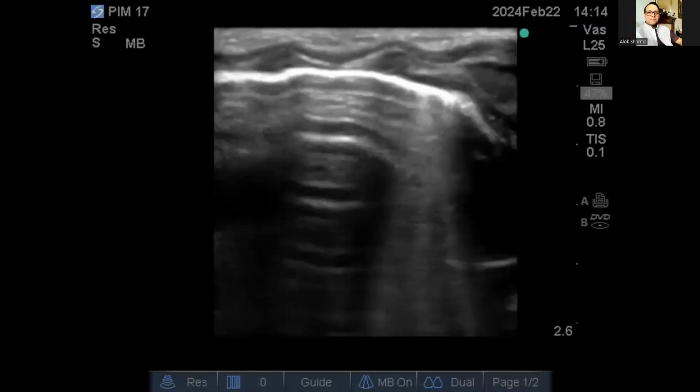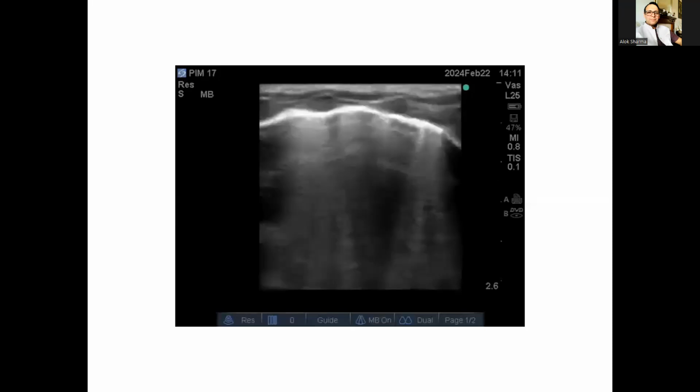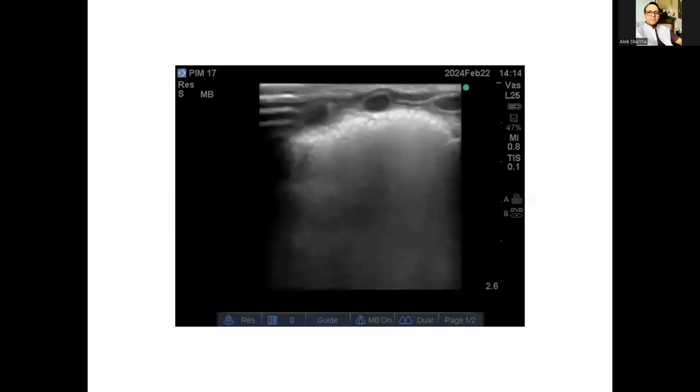So what I'd say is look at your whole scan. I would be doing a comprehensive scan. I'd go to the posterior regions as well. And really, clinically, the feel I'm getting is you have a lot of lung spared areas with decent aeration. If you're just in 30% FiO2 over 28 weeks with a CO2 of 40, there's time to wait and see, which is what has happened in this case. My overall feeling is I think this is probably mild RDS. This is definitely not TTN. You've got a snowflake appearance over here. And I think your baby is getting better.